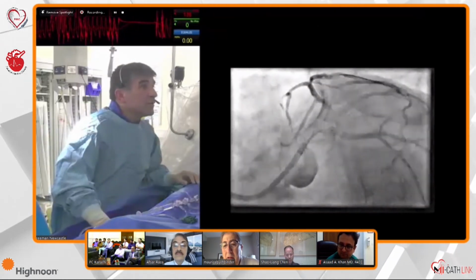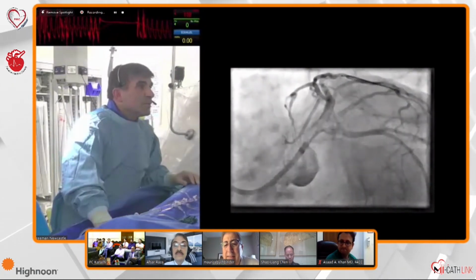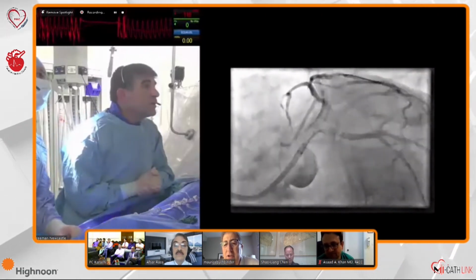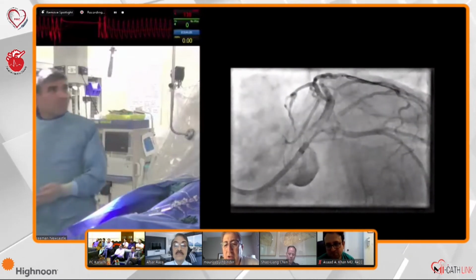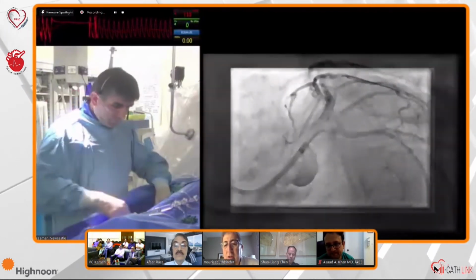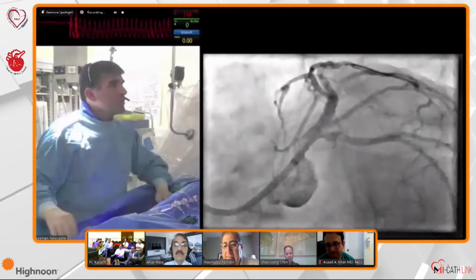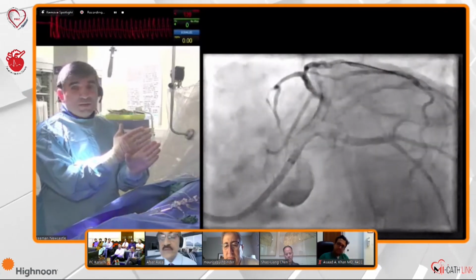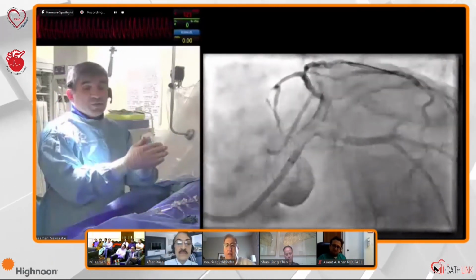Can I have a 3.5 by the left main? LAD is excellent. Very nice. A 3.0 by 12, or no, sorry, 3.5 by 12. Circ, you don't need too much. Don't create too much with it. Yeah, I think I'm just going to do a T because with this stent right now I could see where I need to put my stent in the ostial circ. Beautiful. So you don't have to be worried.